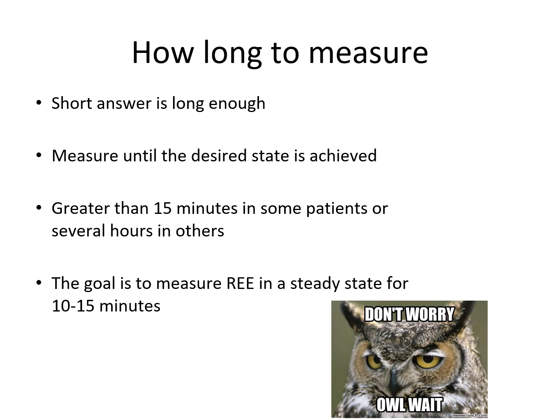So how long to measure? Okay, short answer is long enough to obtain accurate or correct values. So we want to measure until the desired state is achieved. So it just depends. On some patients it's greater than 15 minutes, or other patients it might be several hours. So really the goal is to get a steady state for about 10 to 15 minutes.